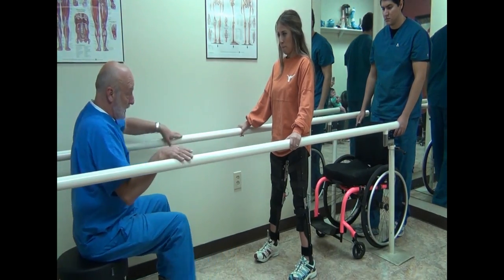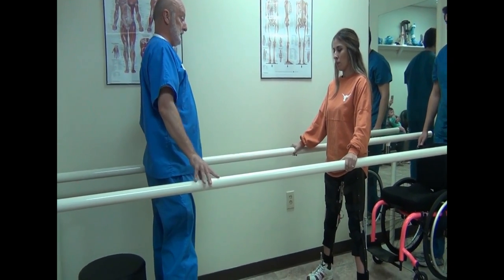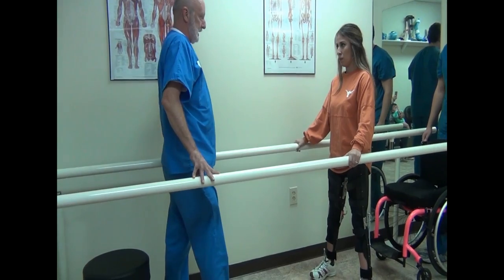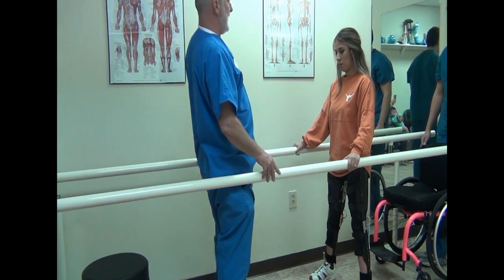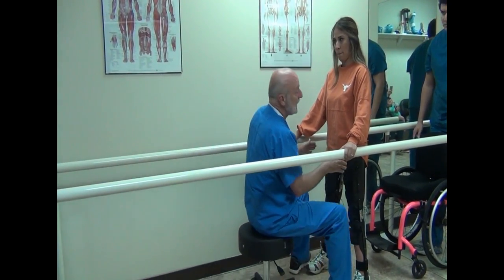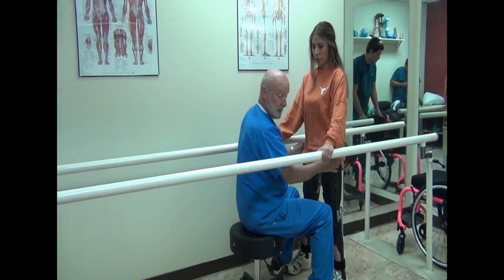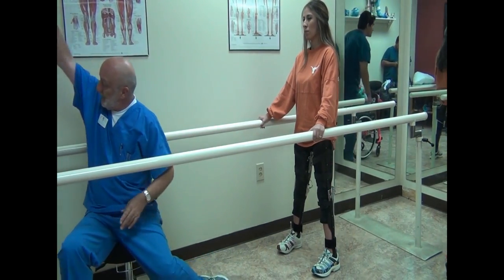To walk, what you're going to do is shift your weight to one side, kind of lean back, and that will almost automatically kick that foot out. Then shift your weight over that foot, lean back, and this leg will come through. Albert, go ahead and put the chair on, and walk behind her in case she gets tired.